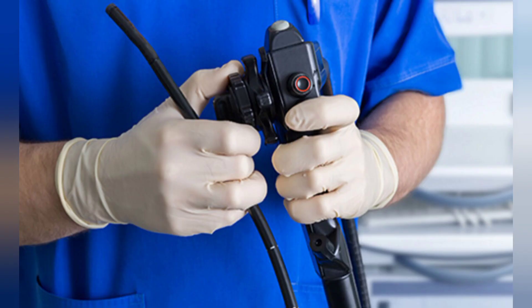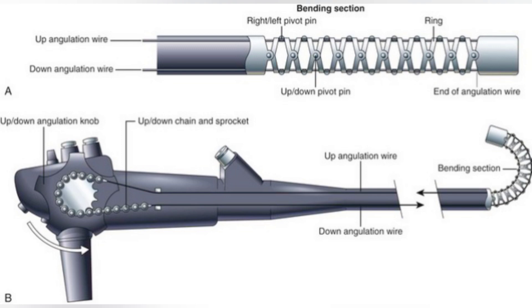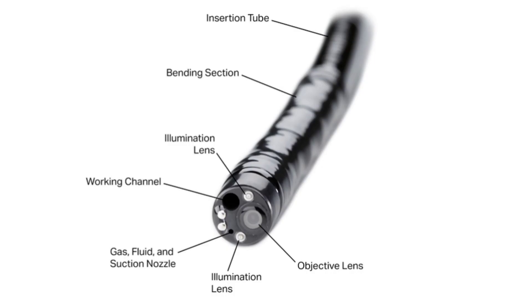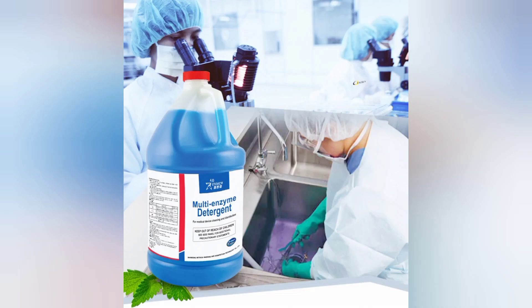This is a flexible endoscope, and this is the ideal way to hold it. The scope is made up of very thin medical-grade rubber and is very delicate. Small channels, cavities, and very flexible strings and wires are encompassed inside the scope so that it can move flexibly. For such a delicate piece of engineering, it is very important to keep it clean and maintain its flexibility.